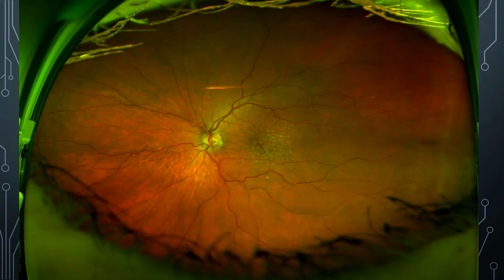So here's some images that we've taken in our practice. We've got tons of them. I thought I'd pick out a few for you. This one, what you're seeing here, the retina itself looks pretty good. This is just an artifact from the flash of light that went off.